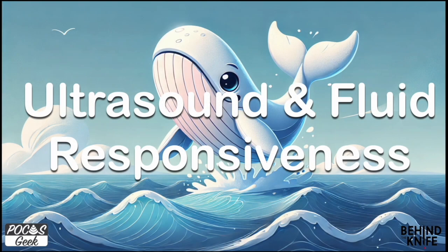I'm excited about the opportunity to talk to you today about ultrasound and fluid responsiveness. I feel like this is the great white whale that we've been trying to find in medicine for quite some time: how to non-invasively check for fluid responsiveness in our most critically ill and hypotensive patients in sepsis, septic shock, or just shock for any reason.